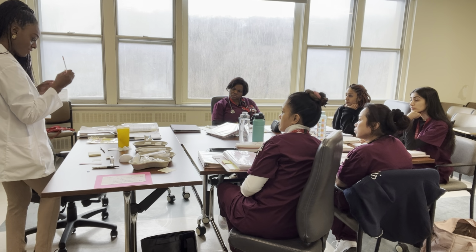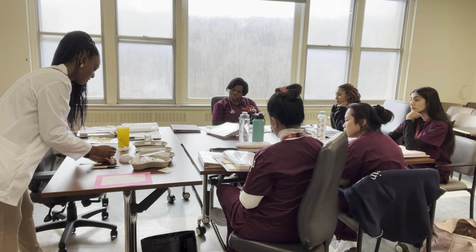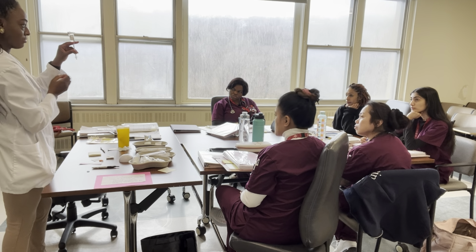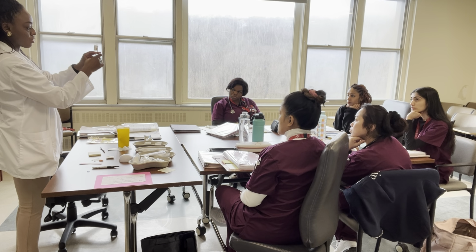So I pulled up my 5 units of air. I cleaned the vial already. I'm going to inject it into the vial. I push air into air. I turn it over. You saw that? And then I'll draw down more than I need because I need to get rid of the air bubbles. So I draw down more.